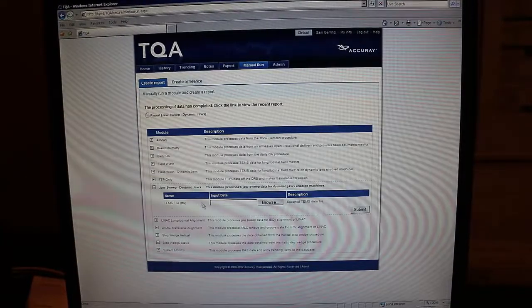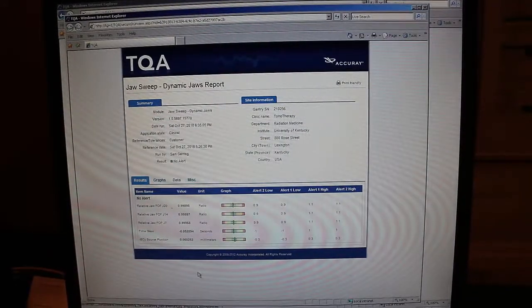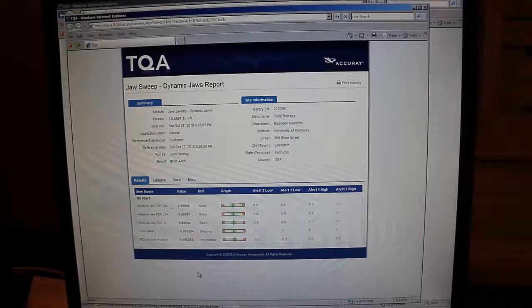When you hit Submit, it will create the report for you, and go ahead and click on that up at the top and you can view your results. And that is it for this video.